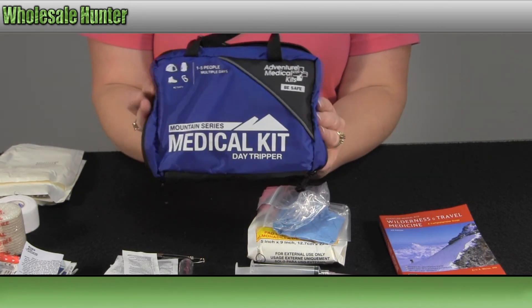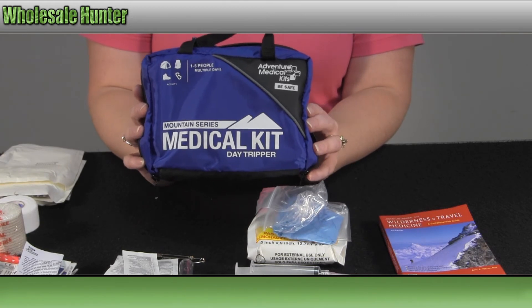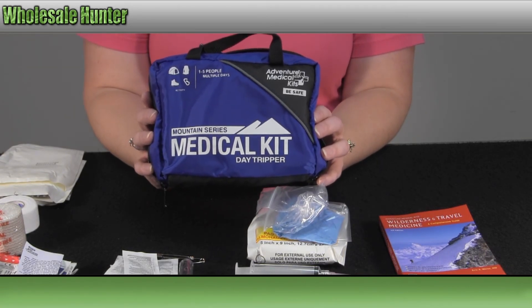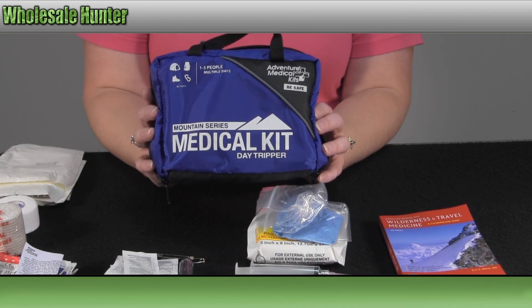This has been the unboxing video for the Mountain Series Medical Kit, Day Tripper Edition, made by Adventure Medical. Manufacturer number 0100-0116.